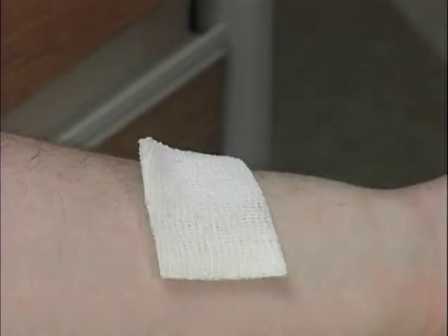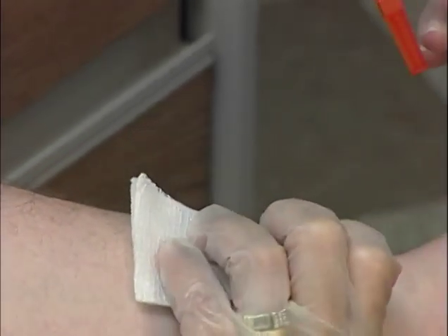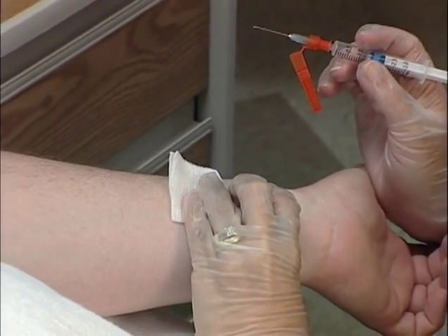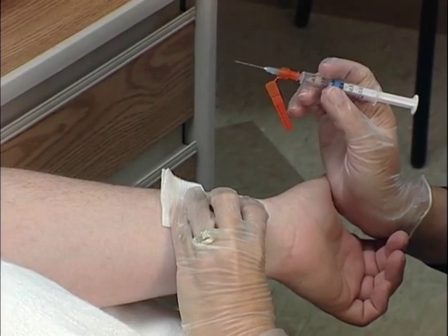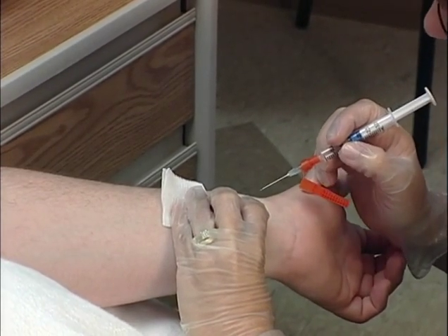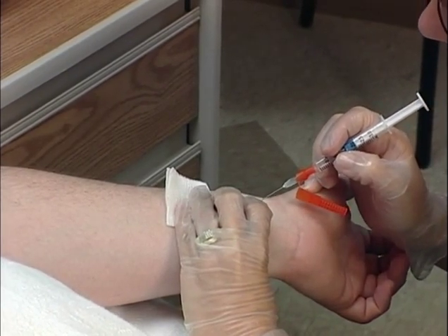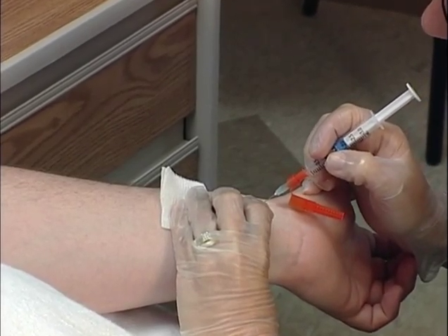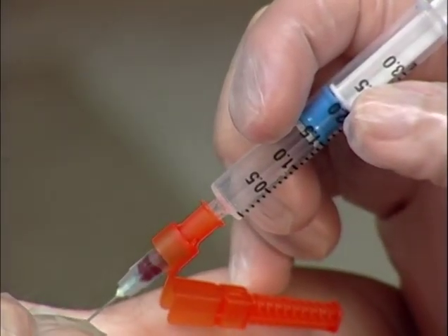Place the gloved index finger of your free hand on the skin directly over the artery, applying light pressure so that the artery can be located but not occluded. Hold the syringe in your dominant hand like a dart between the thumb and index finger. Alert the patient to the impending puncture. With the bevel up, puncture the skin slightly distal to your finger at a 30 to 45 degree angle. Advance the needle into the artery.